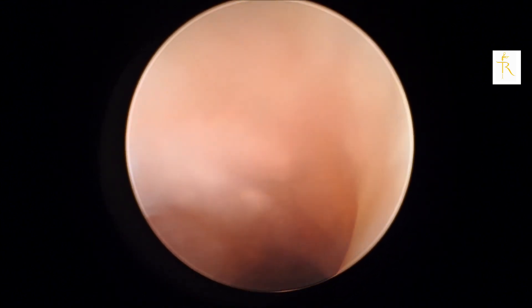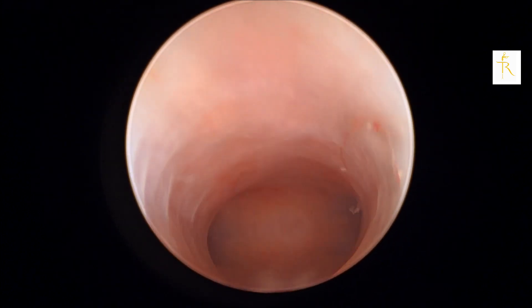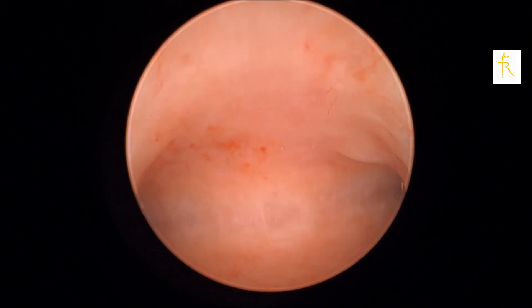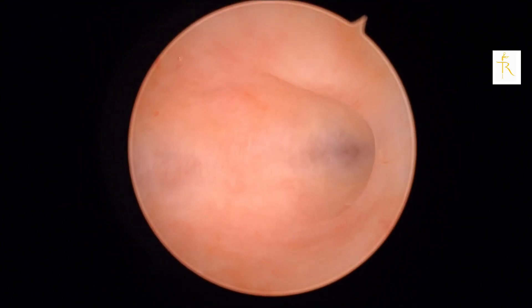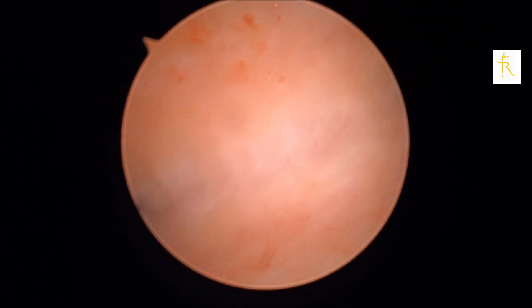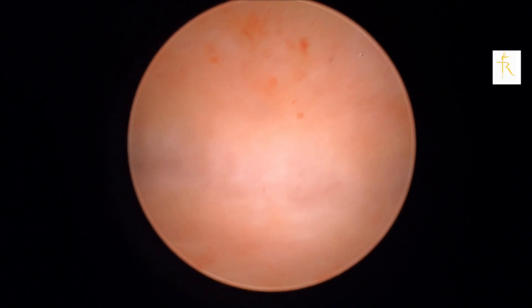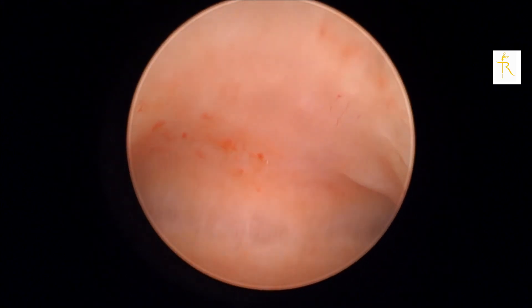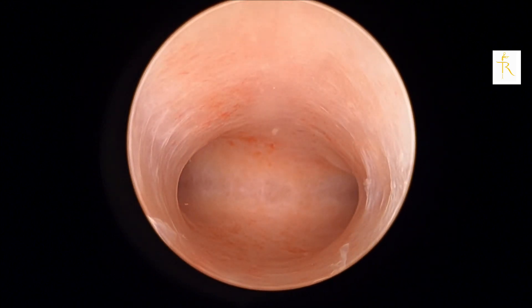Those adhesions are broken down by hydrostatic force alone. You drop your hand a bit further down and negotiate your way slowly further in — and voila, we're in the cavity. Once in the cavity, you assess both ostia: you see the left ostia, turn around 180 degrees and see the right ostia, then pan back for a panoramic view of the entire cavity. Overall it seems quite atrophic.